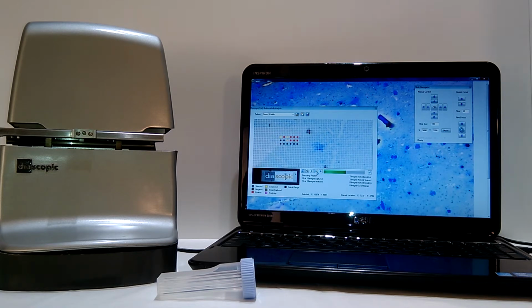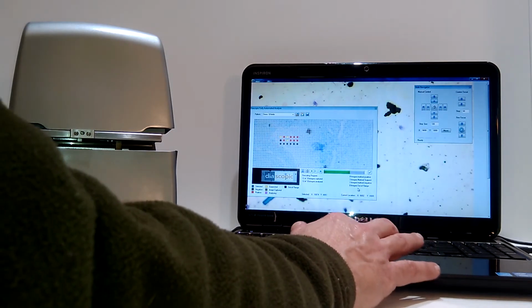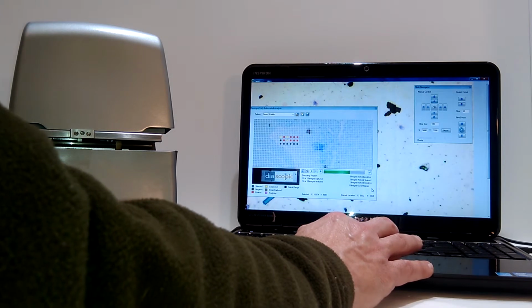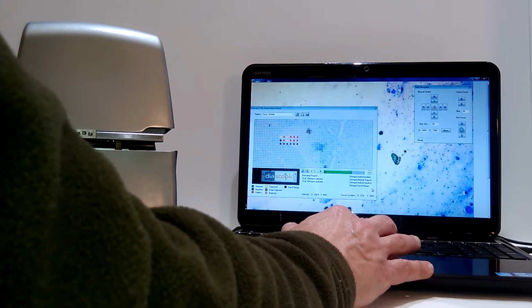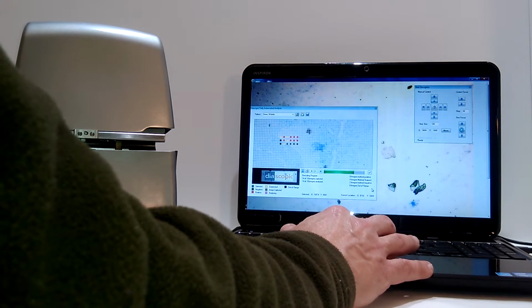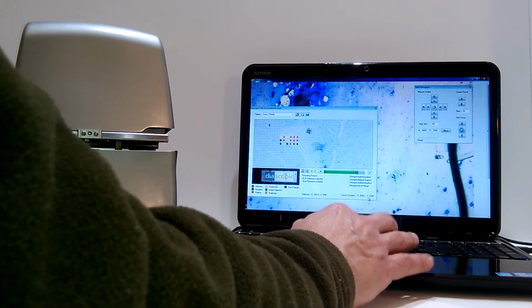The legend down here to the left identifies what's going on with the blocks, and the summary information here to the right tells us what's going on with our slide. In this case, so far, 8 images are positive, 3 are marked suspect, 2 so far are negative, and the X and Y coordinates of where the stage is are identified here.